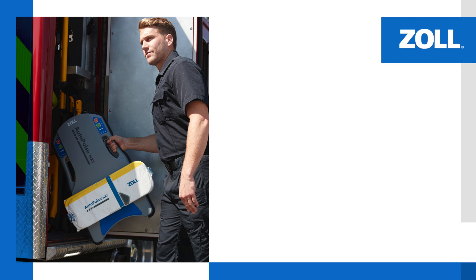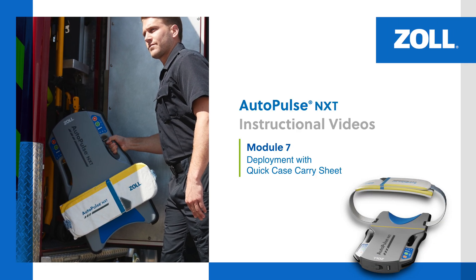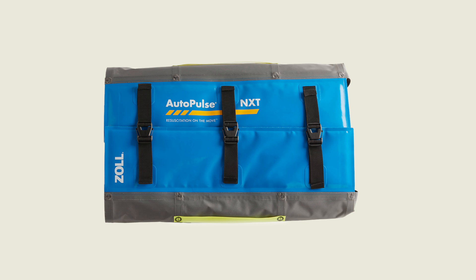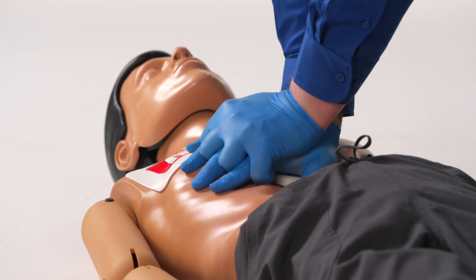In this module, we review deployment of the AutoPulse NXT Resuscitation System with the Quick Case Carry Sheet for resuscitation on the move. The Quick Case Carry Sheet is designed to protect the platform during storage, to transport the platform to a scene, and to transport a patient while the platform is in use.